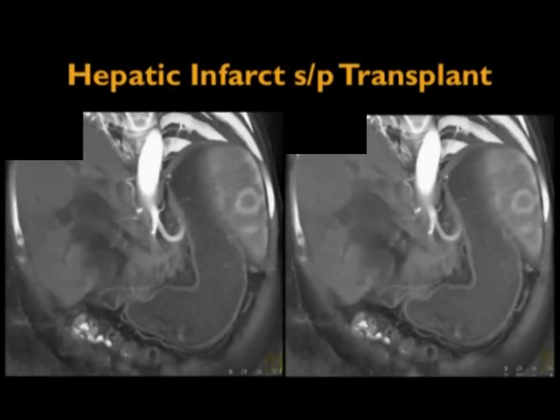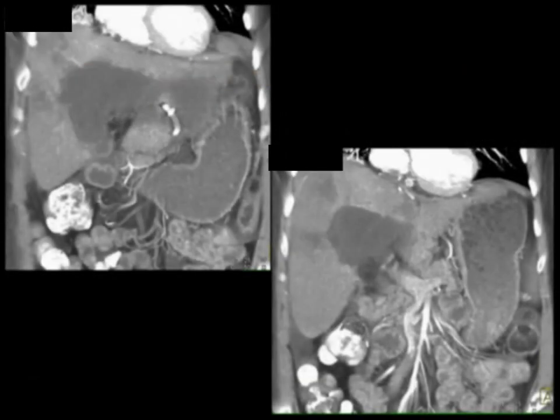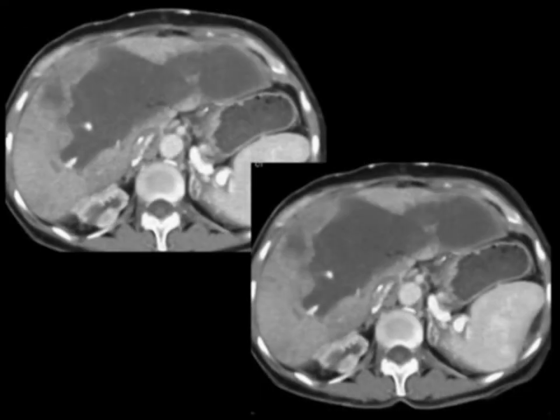Here's a patient who had a liver transplant — the hepatic artery rises up to the celiac and within a couple of centimeters stops because it's occluded. On delayed scans you see low-density wedge-shaped lesions extending into the left lobe of the liver — a very nice example of hepatic infarcts. Infarcts can be focal or global and can destroy the entire liver, sometimes requiring a second transplant. This is something to really be thinking about, particularly in febrile patients. The importance of IV contrast cannot be overestimated in these scenarios.